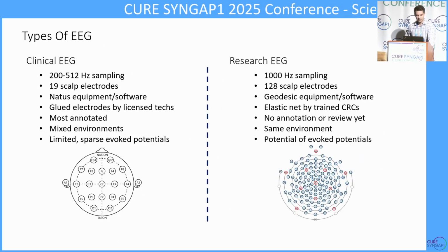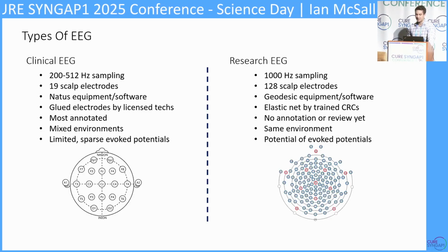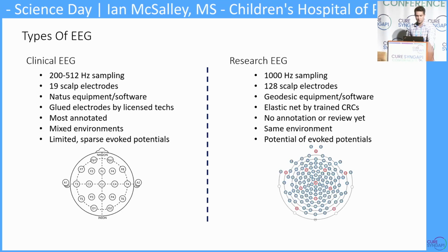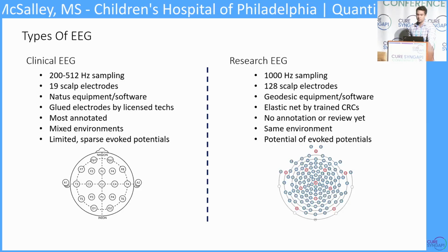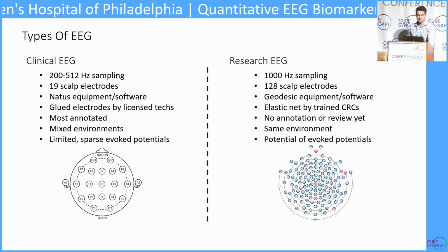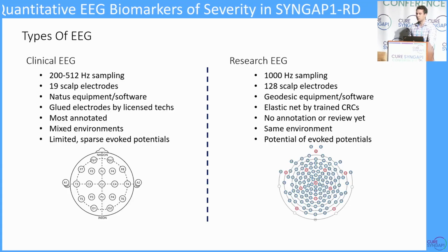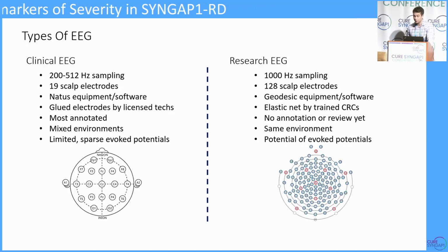And you're probably tired of hearing about different acquisition technologies, but one caveat that is probably worth mentioning before we move forward is that our EEGs come to us in 2 different ways. Our clinical EEGs come from the traditional 10-20 system, and our research EEGs come from this geodesic array I'll introduce in a second. There are many technical differences between these two, but when considering the clinical EEGs, the most important to mention are probably that there are only 19 scalp electrodes and that these are installed by licensed EEG technicians. In our ENDD research clinic, we have a 128 electrode array assembled in an easily adorned elastic cap, which sort of resembles a swimmer's cap. And these are generally put on by our research coordinating team, who are trained but are not qualified technicians.